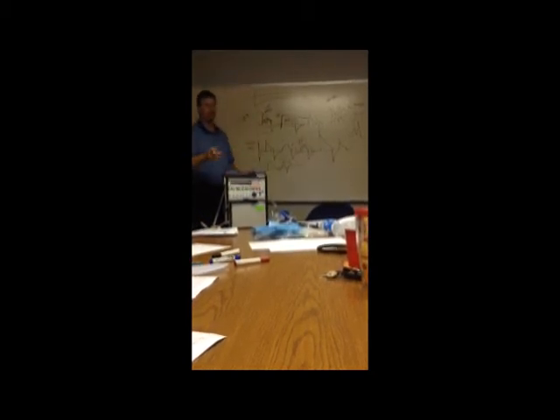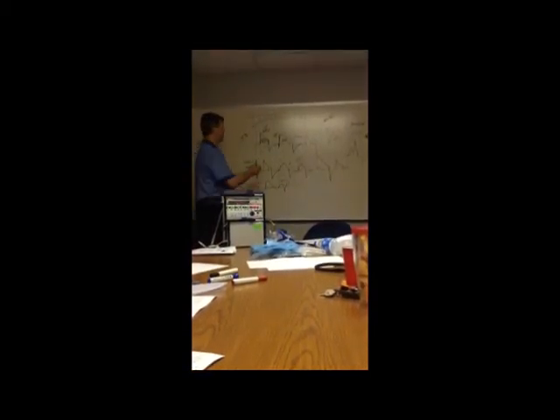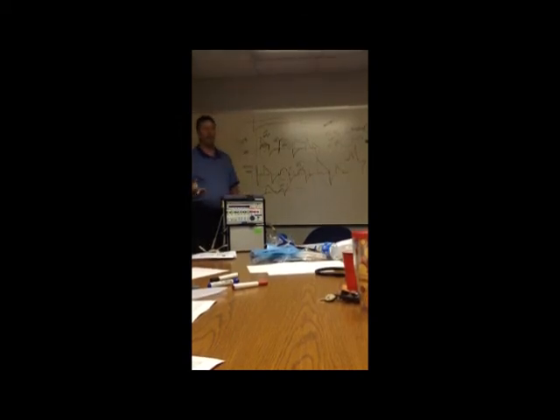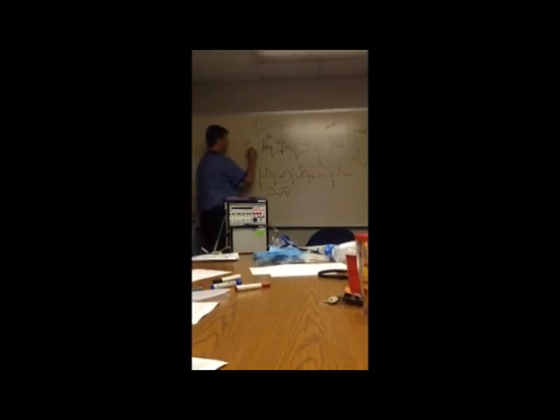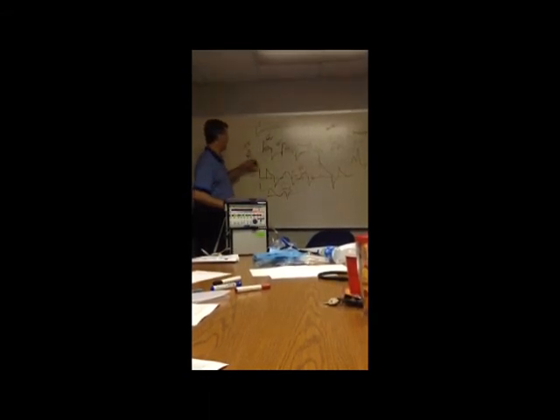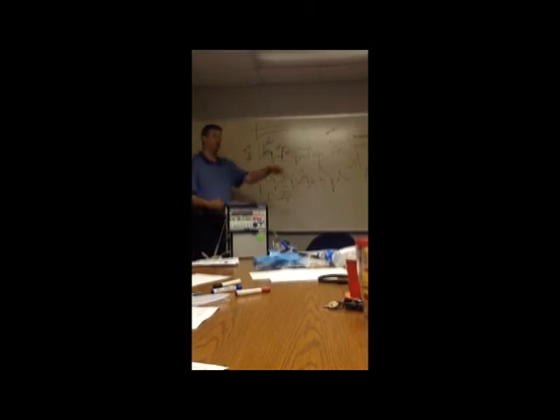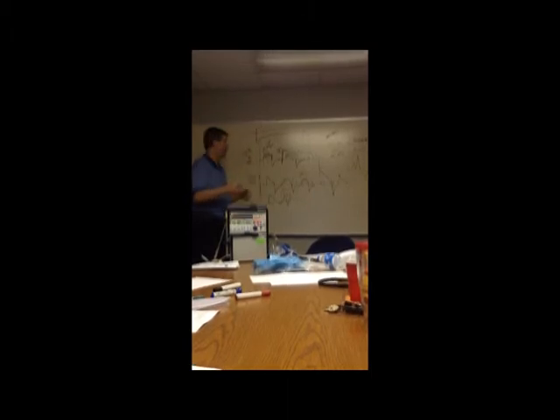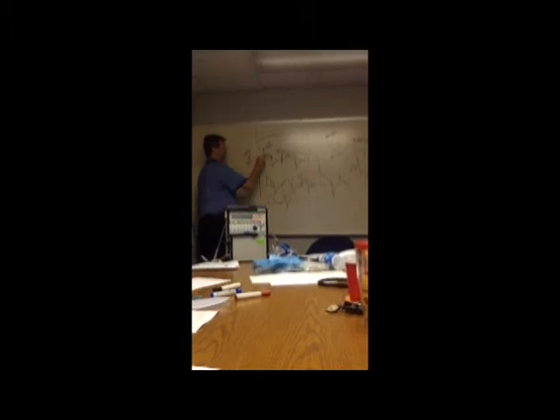So the only thing that can vary, depending on if their lungs are stiff or if they're working against you, is the pressure it takes to get that. If I blow 500 in somebody, great athlete, good lungs, nothing's wrong, the peak pressure may be 20. If I blow 500 in somebody in CHF who's got really wet lungs, the peak pressure could be 35. I had the same amount of air going in two identically built, sized people. Their lungs should be the same. The only difference is B's lungs are stiff, so it reaches that pressure before it gets that much air in.